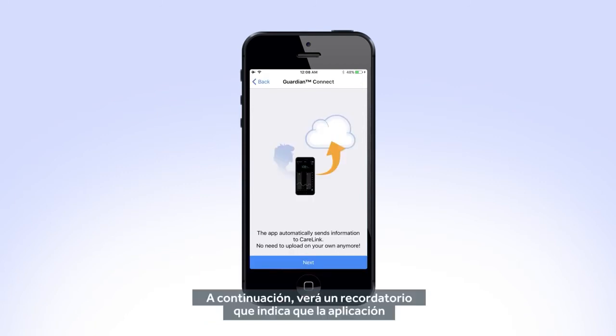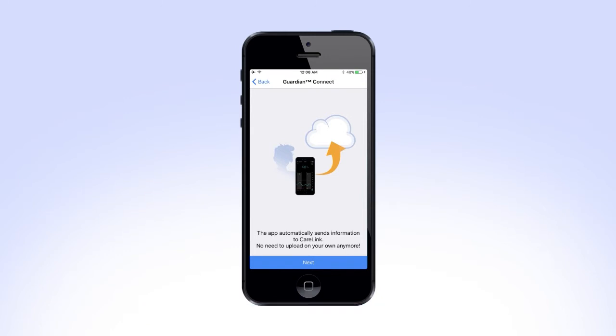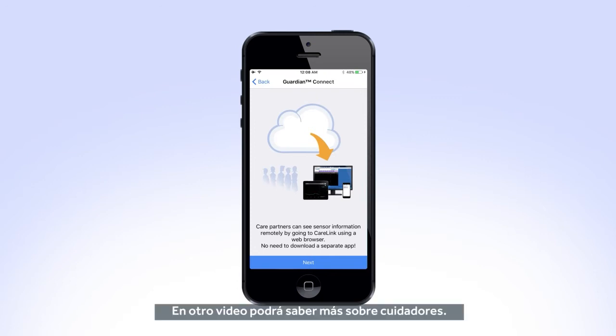Next, you will see a reminder that the app automatically sends your information to CareLink. Select Next. Now you will see information on Care Partners. You will learn more about Care Partners in another video. Tap Next.